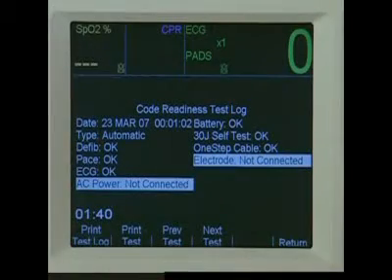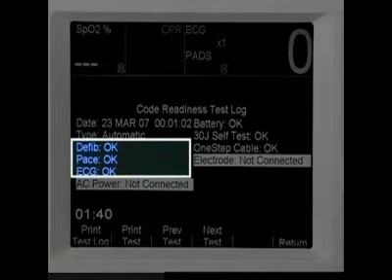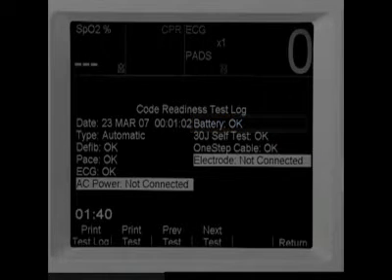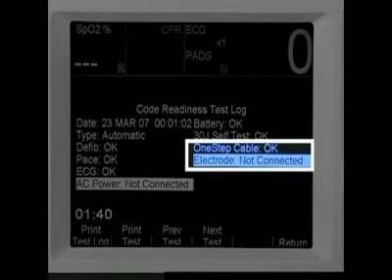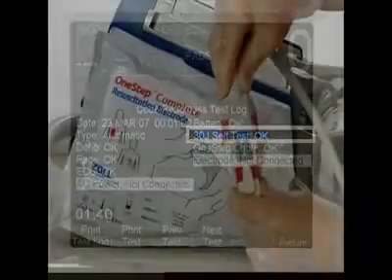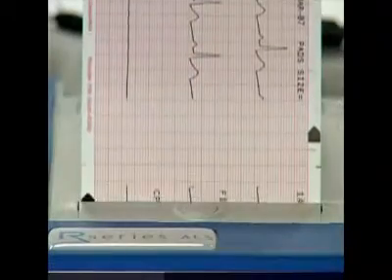The R-Series automatic testing verifies that the circuitry for ECG, pacing, defibrillation, and CPR feedback is functional, that the battery charge level is sufficient for at least 1 hour of continuous monitoring and 10 shocks at maximum charge, that the one-step pacing, CPR, or complete electrodes are attached to the unit, and that they have not expired, and that the gel has not dried out, that the device can deliver a 30-joule test shock, that all cables are functional, and that the printer is functional.